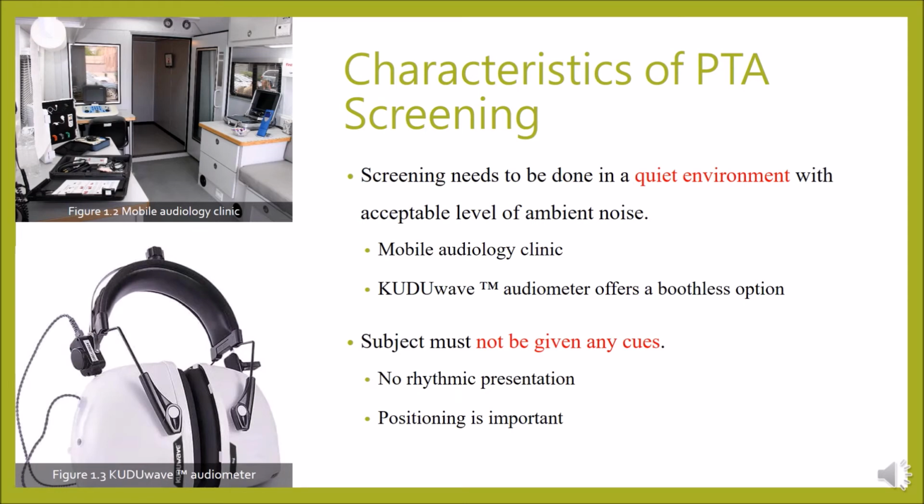Screening needs to be done in a quiet environment with acceptable level of ambient noise. My friend will further explain after this regarding ambient noise level check, but basically ambient noise is the background noise in a scene or location. For that, we usually find a place that is naturally quiet such as libraries or management office.